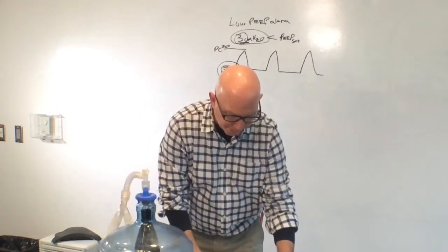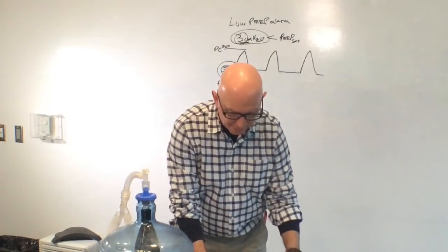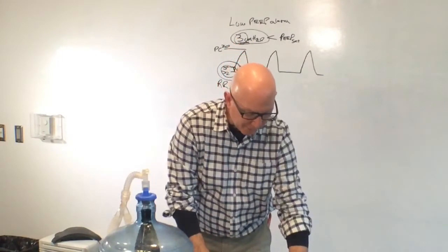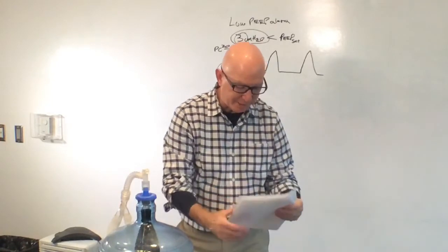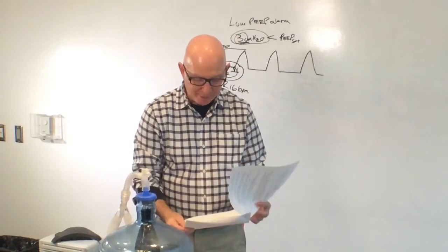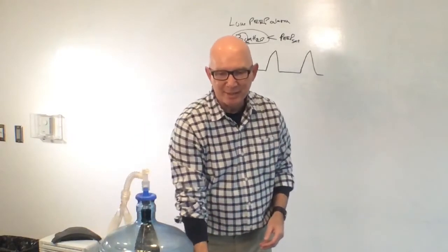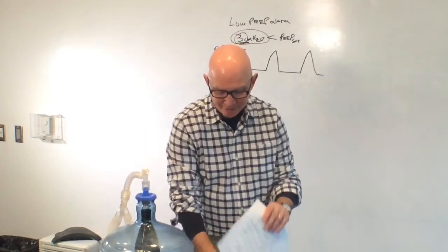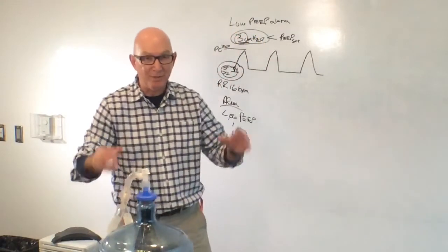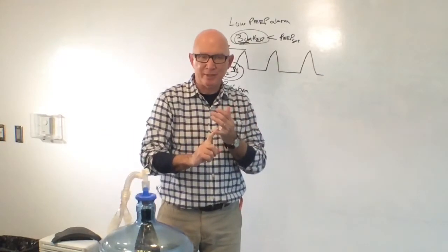Good. So I think that answered most of the questions, and in addition to that, it addressed some of the things that I wanted to cover today. But I've got a bit of time here, about another 30 minutes, and I want to talk about patient-ventilator interaction. The literature demonstrates that dyssynchrony between the patient and your ventilator happens on a regular basis. And if we go back to what the ideal ventilator breath would look like, it would be one that would trigger as soon as the diaphragm starts to contract.